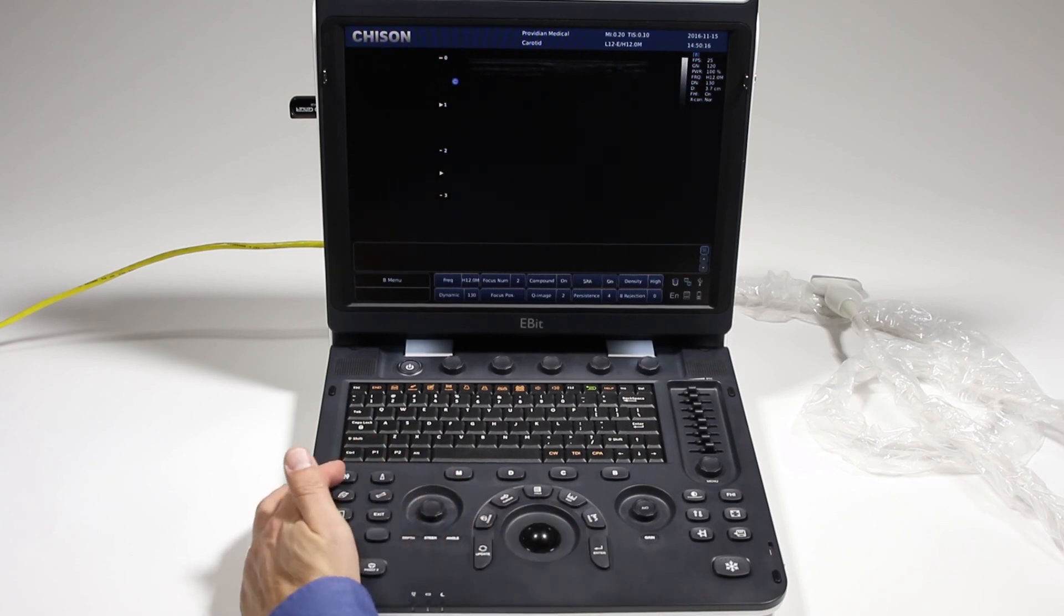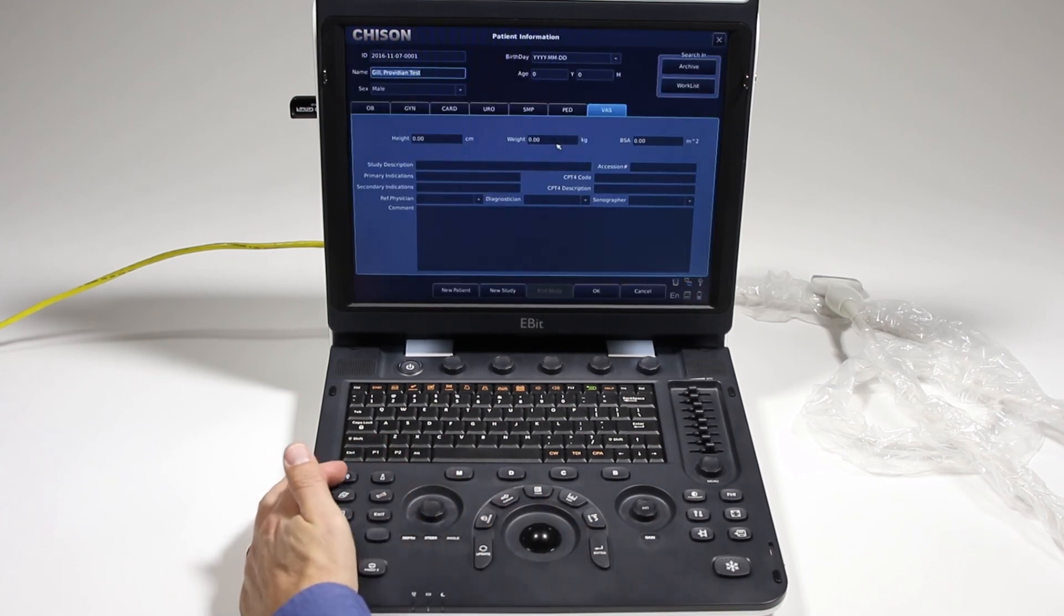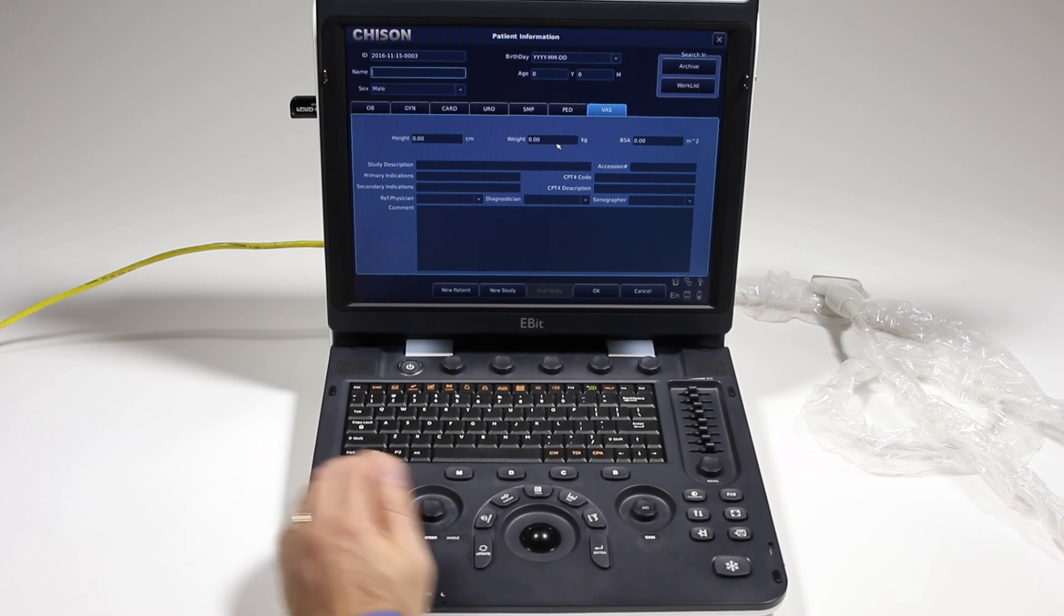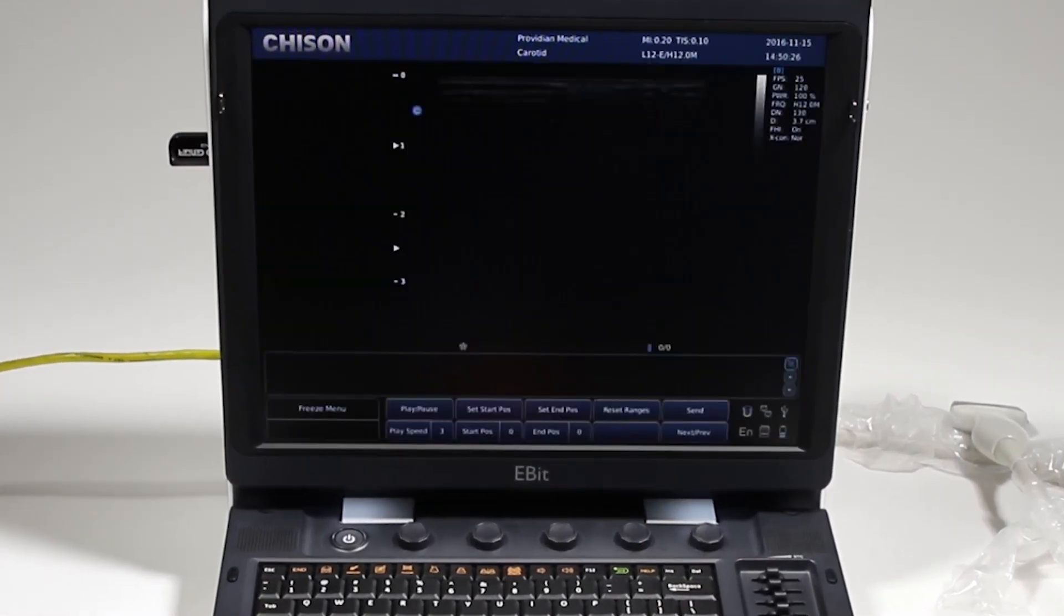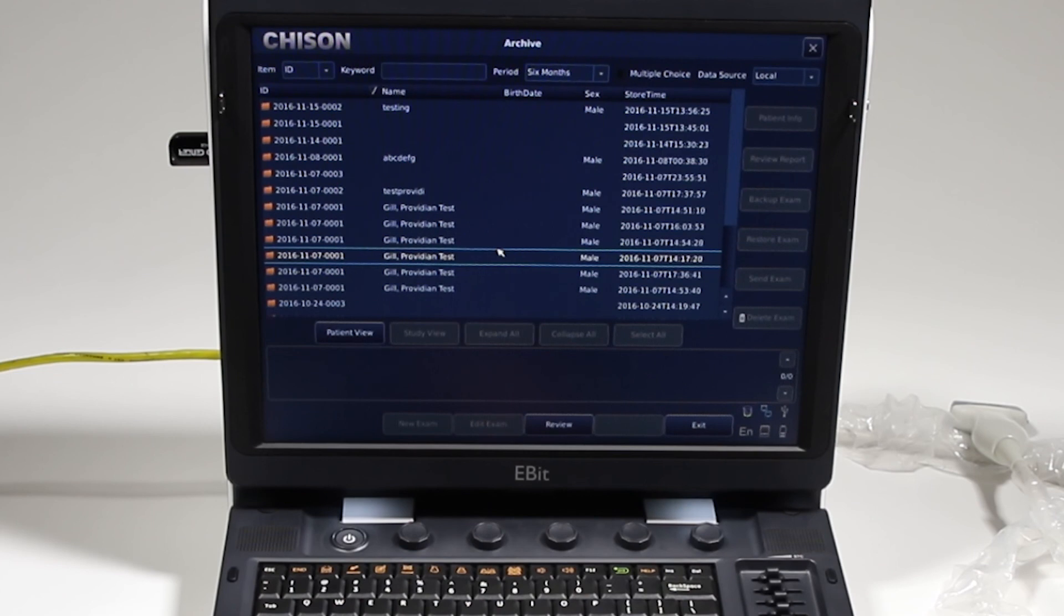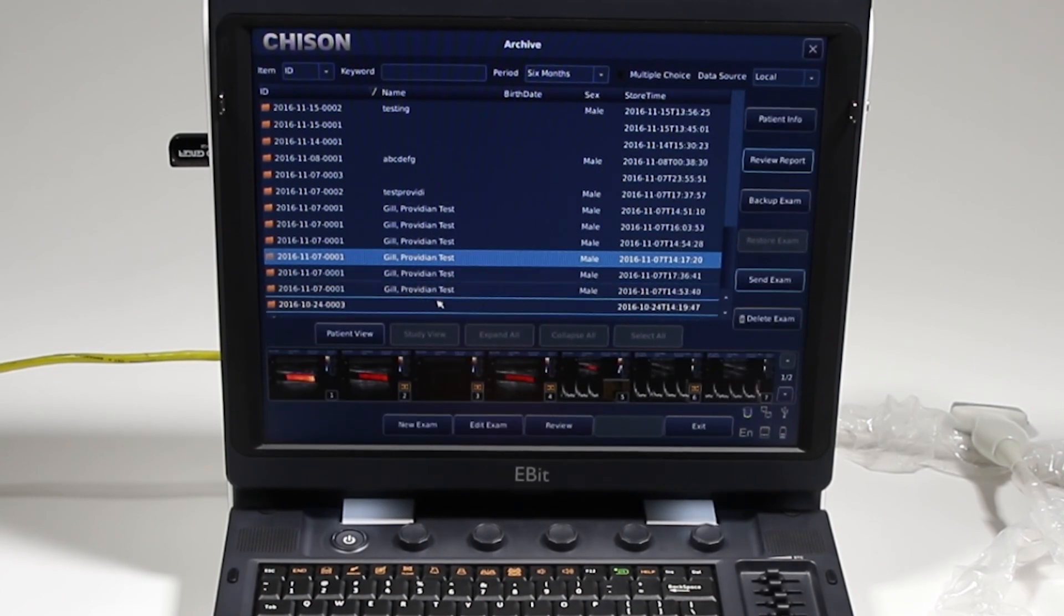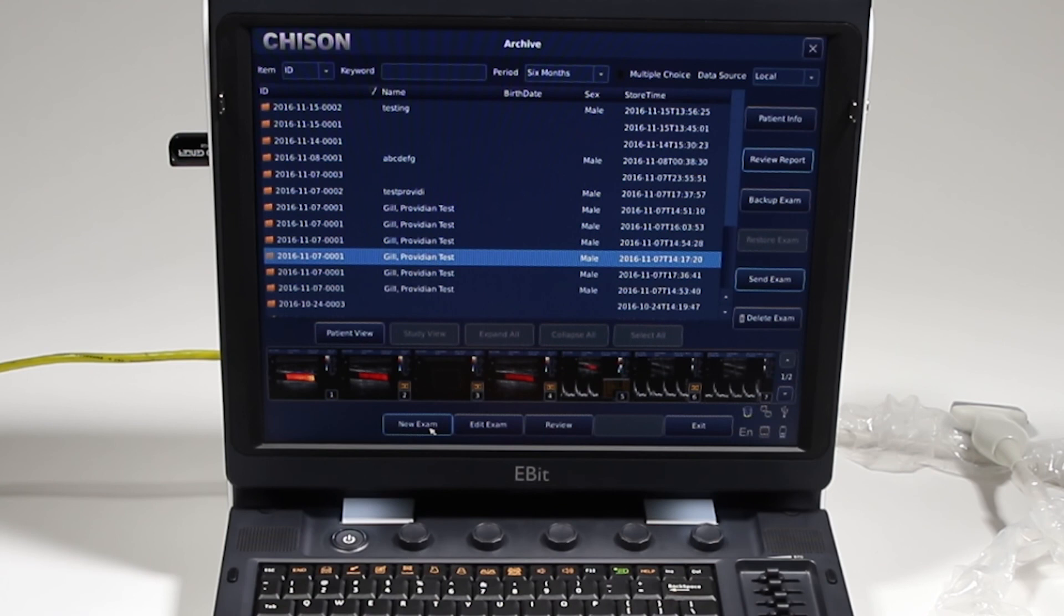Now, another item, another way to get to that archive screen is to press that patient button, and up here, you can search the archive, and you're back at this, where you can choose this patient, then create a new exam for that patient.